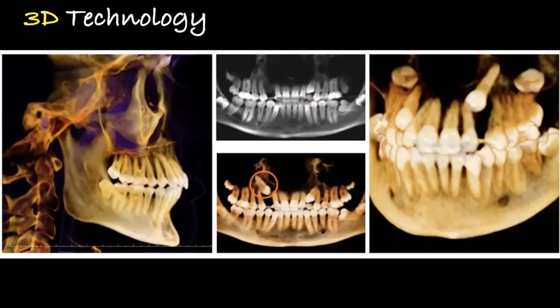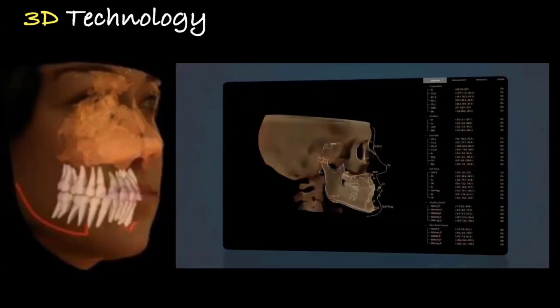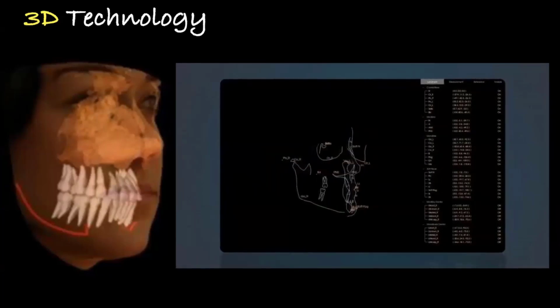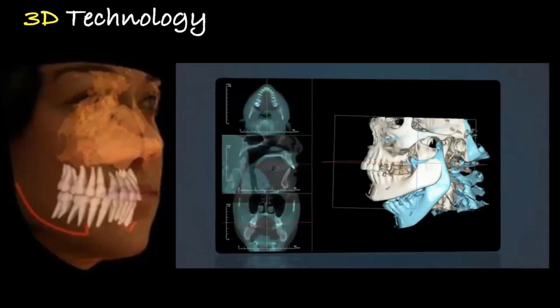And from a standpoint of getting insurance approval, if you send one of these images, especially, we send them all the time to insurances, that has a whole bunch of three-dimensional stuff, we've never not gotten approval because of that. And the beauty of things like airway allows you to really just utilize things. But from orthodontics, you can really look at this and look at your lateral cephalometric analysis. You can do subtraction radiography, which we do to make sure there's some jaw growth that's completed.